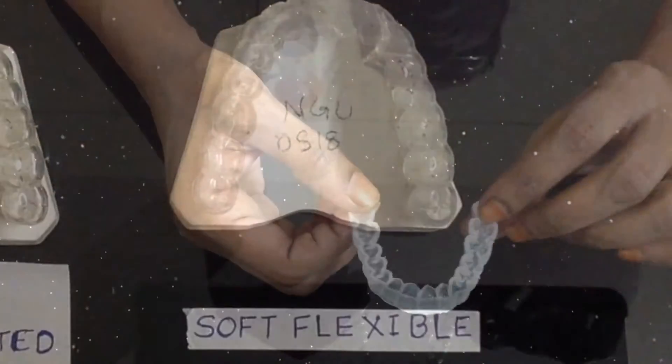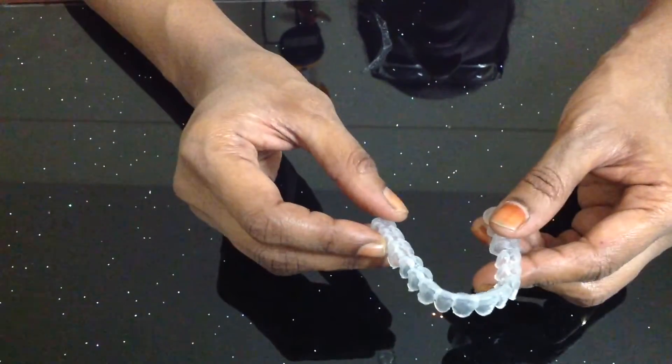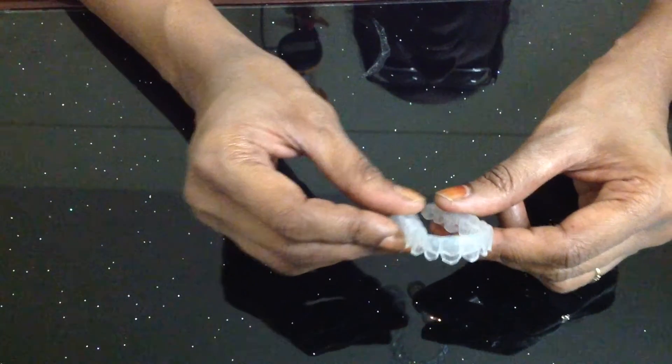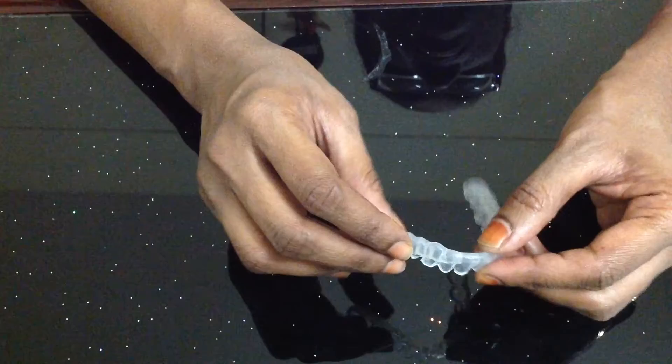The second one is the soft flexible nightguard. This guard is fabricated from 2 mm of soft flexible comfortable material. Indication: this guard works well for heavy teeth clenching and less night grinding. However, if the patient is a moderate to heavy grinder, this guard cannot tolerate the stress of grinding.